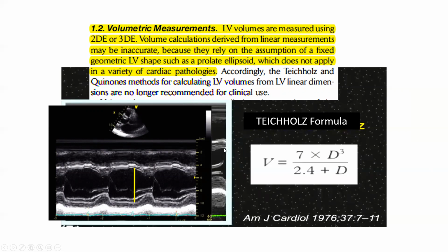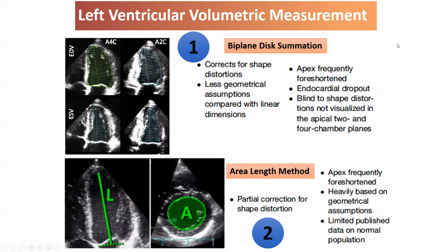Again, this is pretty much off the record, but if someone asks you in a normally shaped ventricle what the volume is, if the diastolic dimension is 5, you can tell them 125 cc's. But if the question comes up on the board examination, we are quantitating left ventricular volumes by 2-dimensional or 3-dimensional techniques and not the Teichholz method.